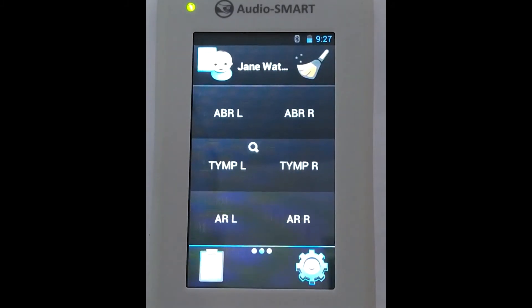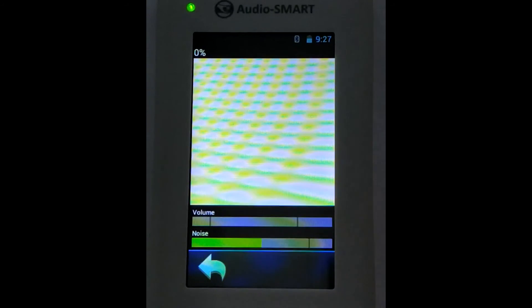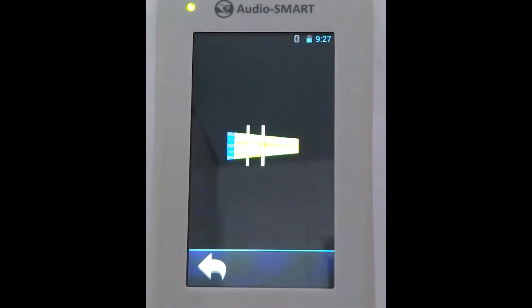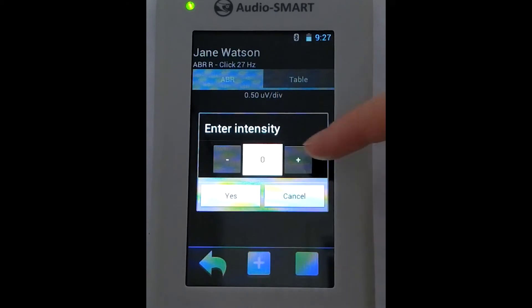Now we are ready to perform the ABR test. We have positioned our electrodes, and after our child became asleep, we positioned the probe. We choose the proper site of stimulation. The system reveals the quality of positioning of the electrodes and the probe, and after that it asks us to enter the maximum intensity level.